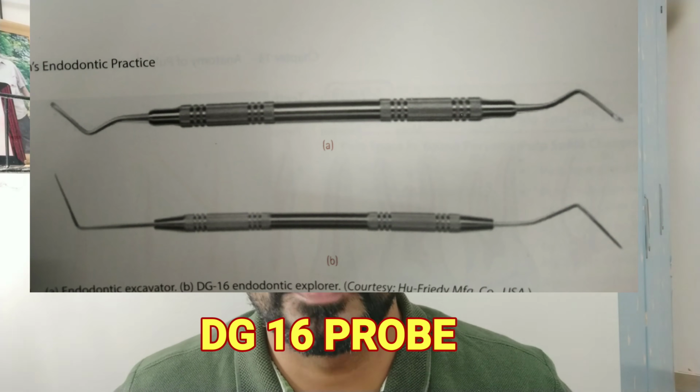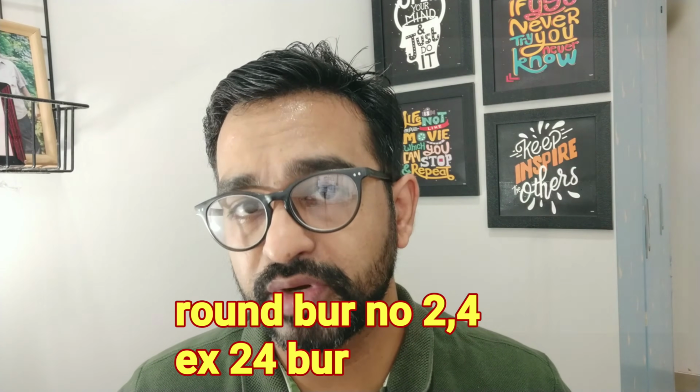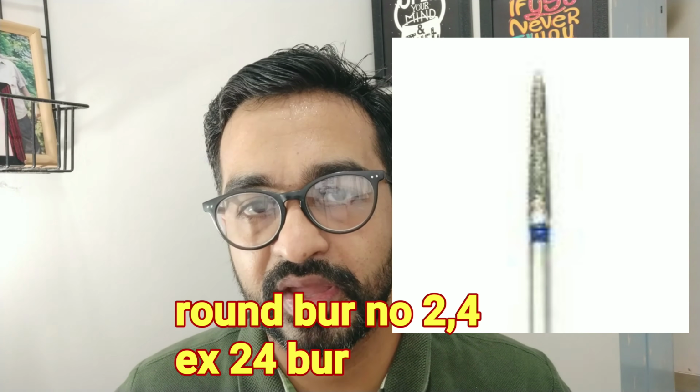Before starting the RCT, there are a few instruments and a few things you have to keep in mind in order to find the canals. The first instrument, which is very essential for every beginner, is the DG16 probe, which you need to have in your clinic. There are only 3-4 instruments you need: number 2 burr, number 4 round burr, and an EX24 burr with a non-cutting tip, as well as the DG16 probe.